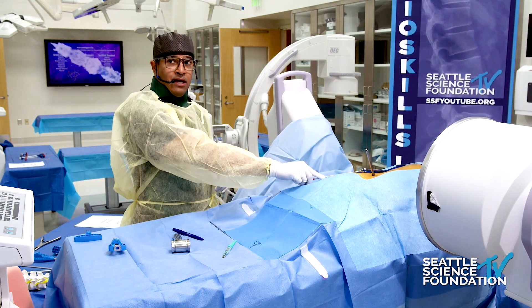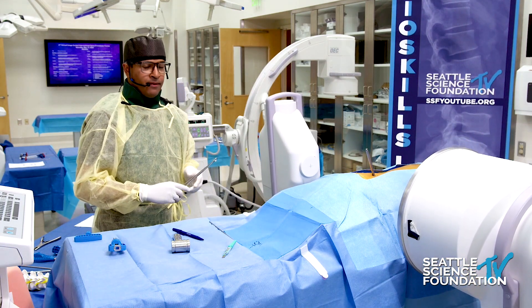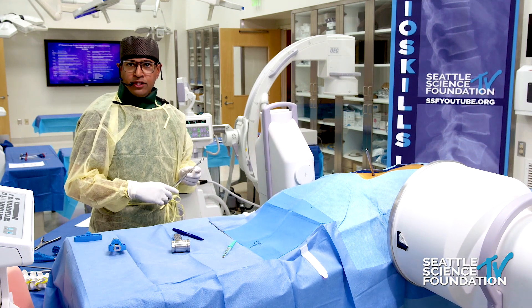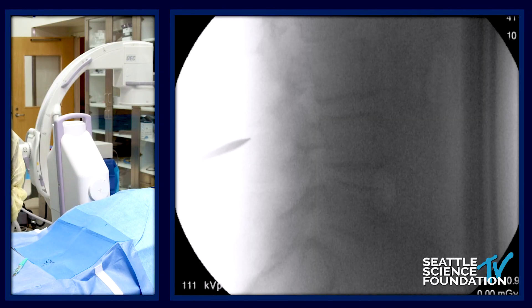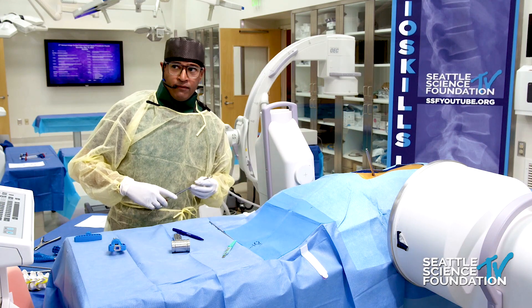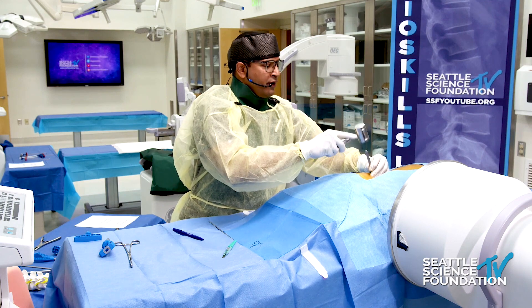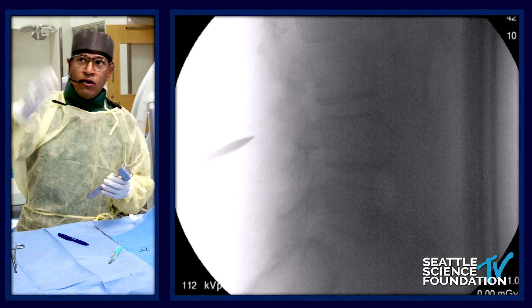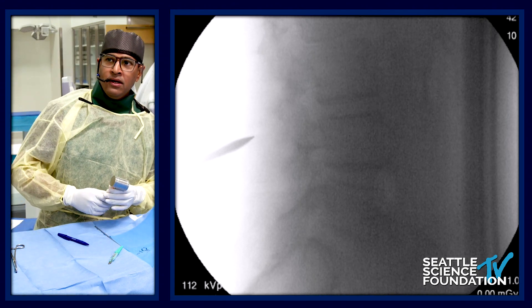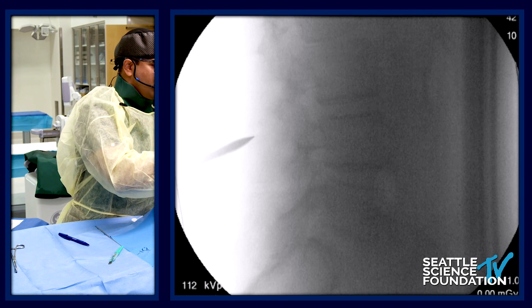On the side of the instrument you can see the depth markings in millimeters, which helps us understand how deep we are. Dilator 1 is in the interspinous space between the L3 and L4 spinous processes. I'm going to advance dilator 1 to what's called the spinal laminar line — the shadow of the lamina, which is the zigzag formation on your screen.